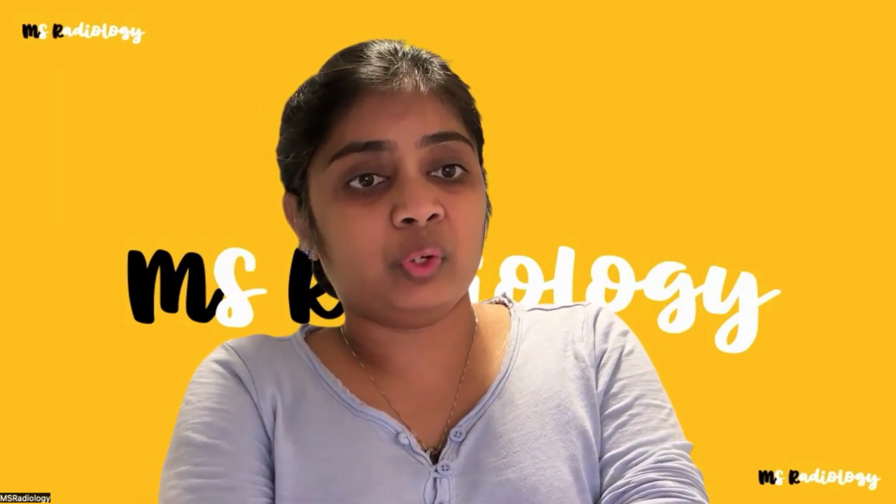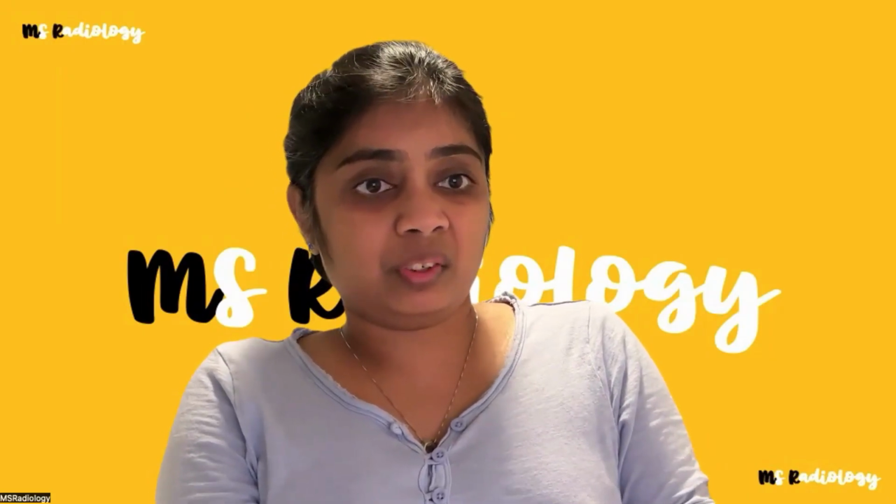Now, the most important thing that I say to all my clinicians and medical students is don't worry about what particular CT or what particular phases you need to request. The thing that I would like to know is the focused clinical question.